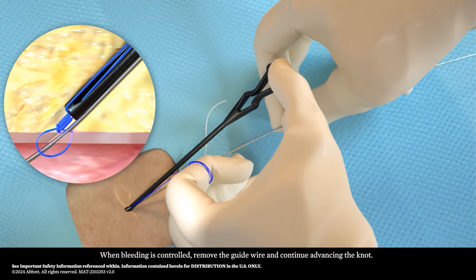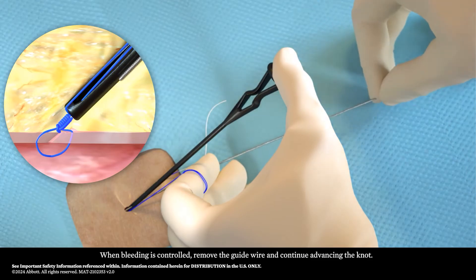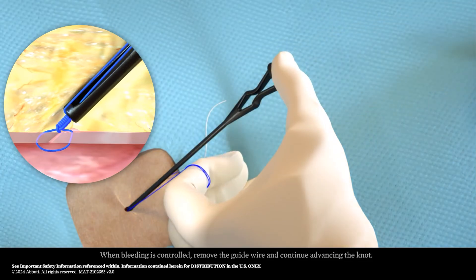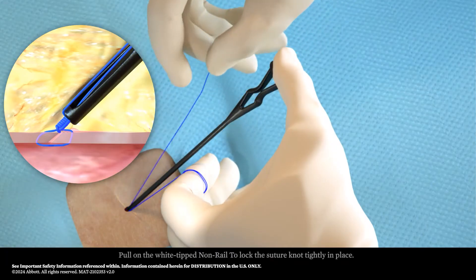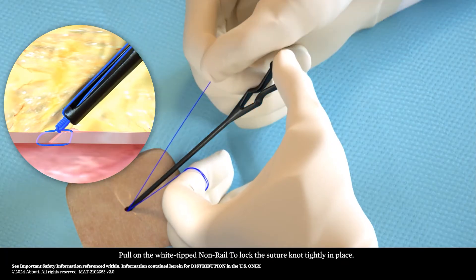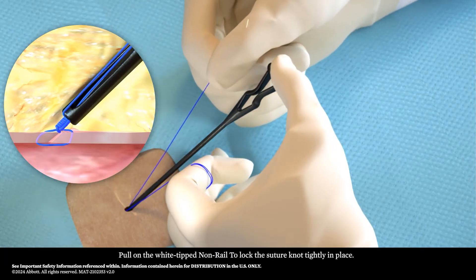When bleeding is controlled, remove the guide wire and continue advancing the knot. Apply slow, consistent increasing tension. Pull on the white-tipped non-rail to lock the suture knot tightly in place.